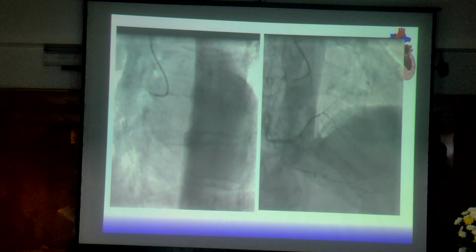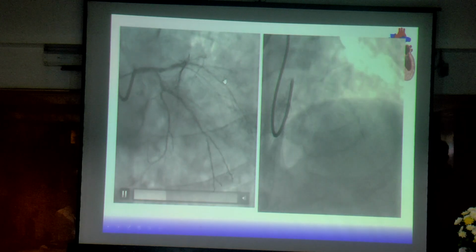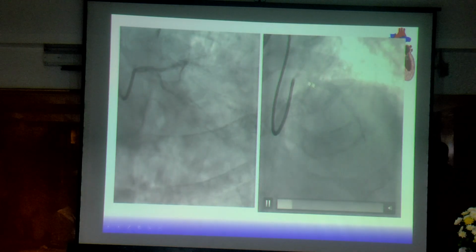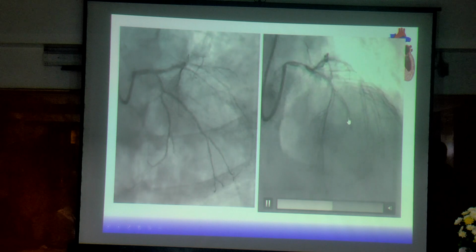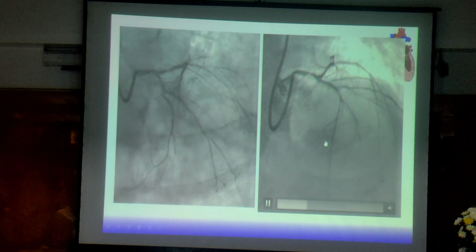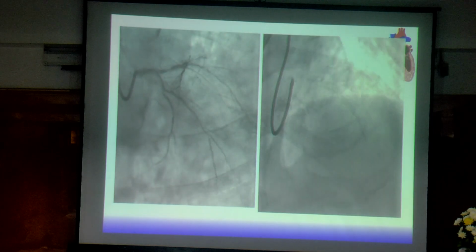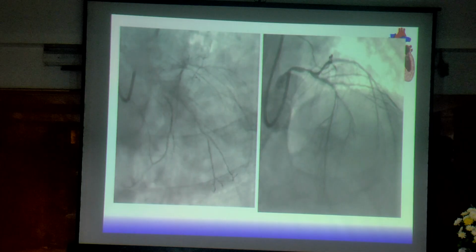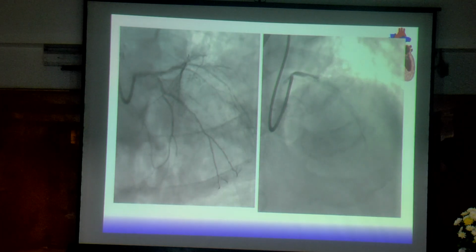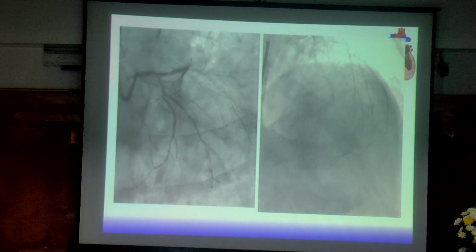You see, severe disease. The right coronary artery is essentially normal, and the circumflex is also essentially normal. But see, the ventricular contraction is so poor, and the entire LAD is completely occluded and heavily calcified, diffusely, totally blocked here. So this is a common presentation of diabetes. We are lost. Can't do anything. This patient is on medical management. Can't do CABG bypass surgery or offer any angioplasty. So he has restricted his life, on medication for heart failure.